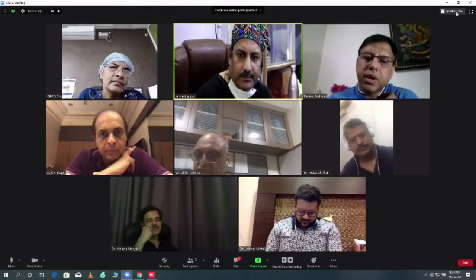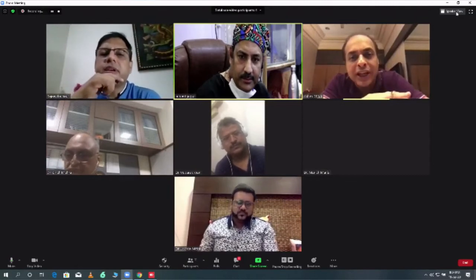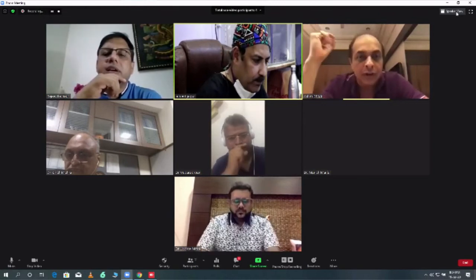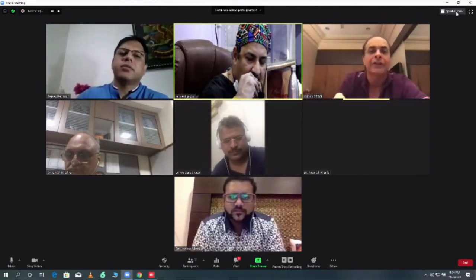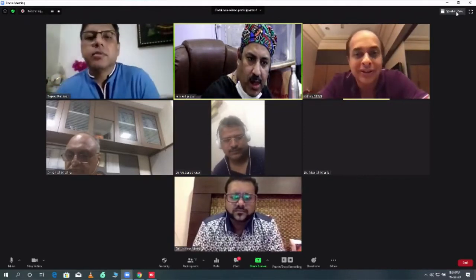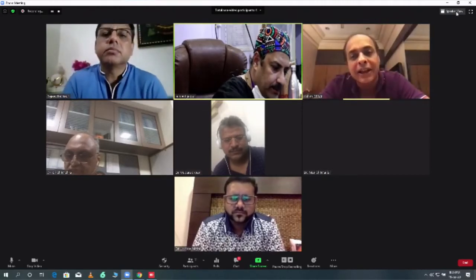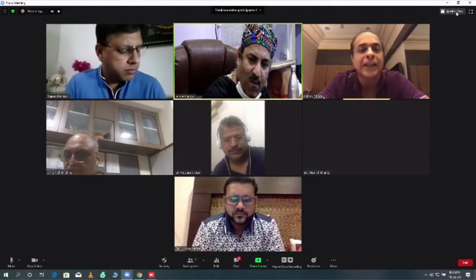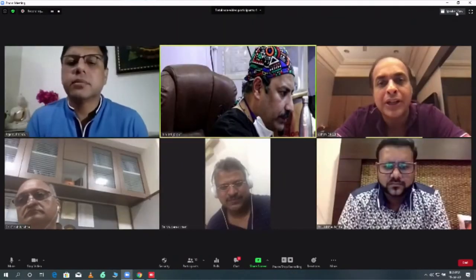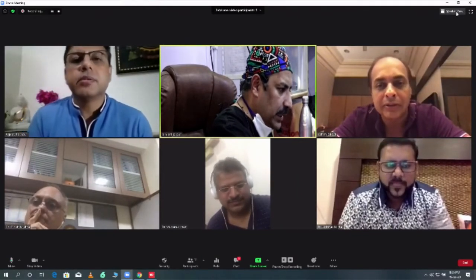That's it. And Ashim is using it now. No, honestly, Satish, I have been using a laser with a hollow waveguide from 94 onwards. The Luxar lasers were the first lasers in the world with a hollow waveguide, a semi-flexible CO2. So since 1994, I've been using those. But unfortunately, the power delivery system was not precise till I rediscovered the Luminous, thanks to you. About 7 years ago, you showed me the Luminous. That's when I started using it. And since then, he has been using it regularly.